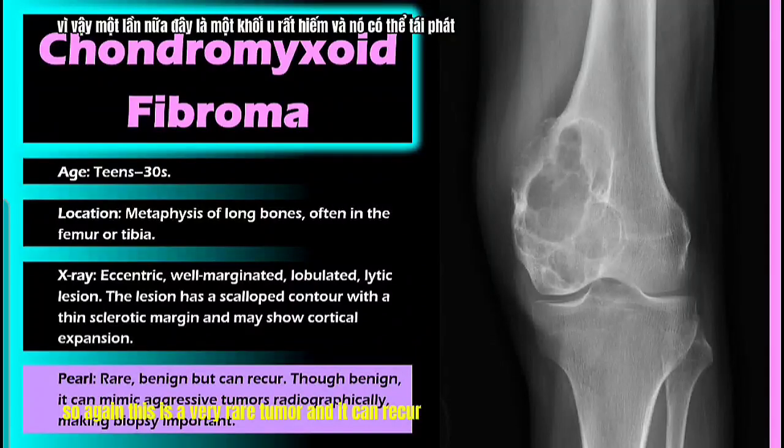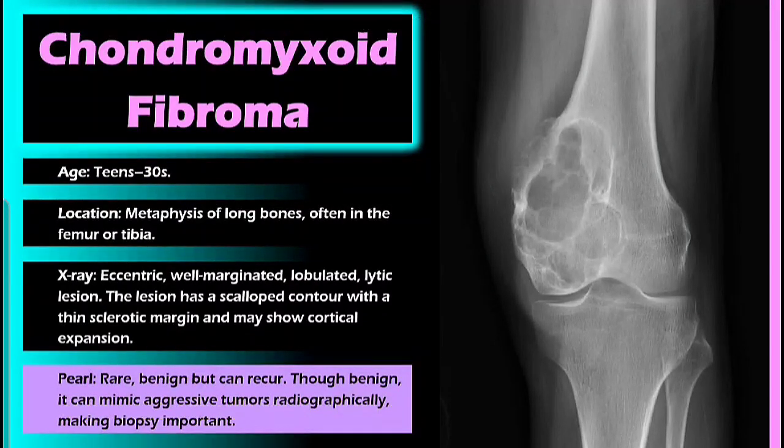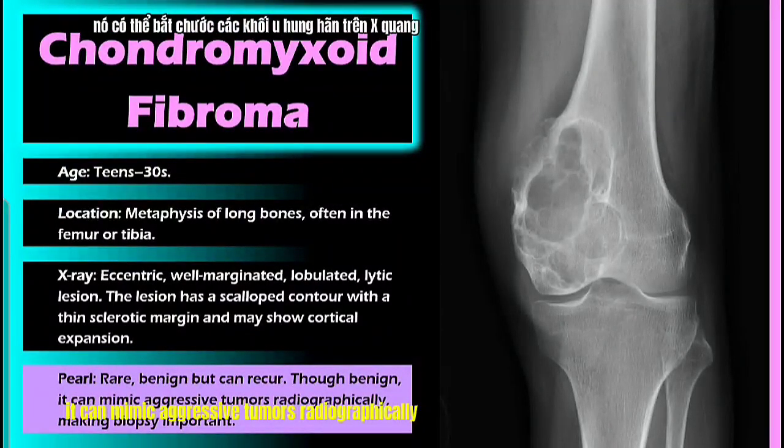So again, this is a very rare tumor and it can recur. Though benign, it can mimic aggressive tumors radiographically, making biopsy important.